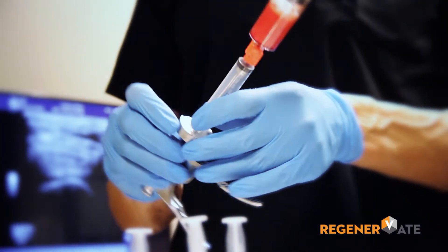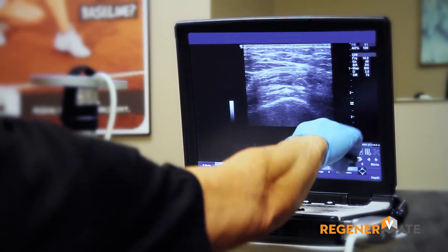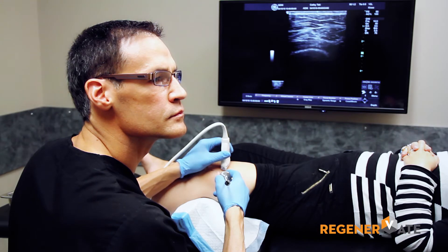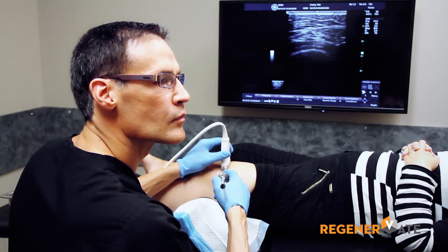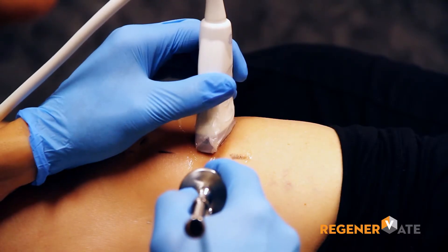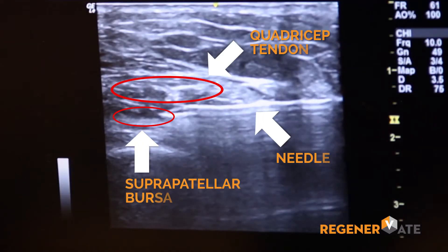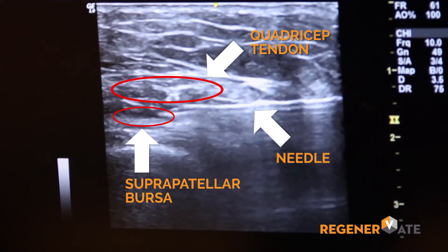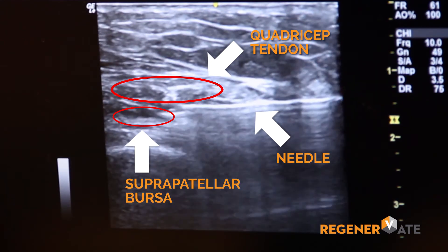We once again turn our attention to the patient, mark our target area using ultrasound guidance, and then guide the needle into the target area again using the ultrasound machine. We then inject. We use lots of freezing or local anesthetic in these procedures, so it really is very comfortable and very well tolerated.